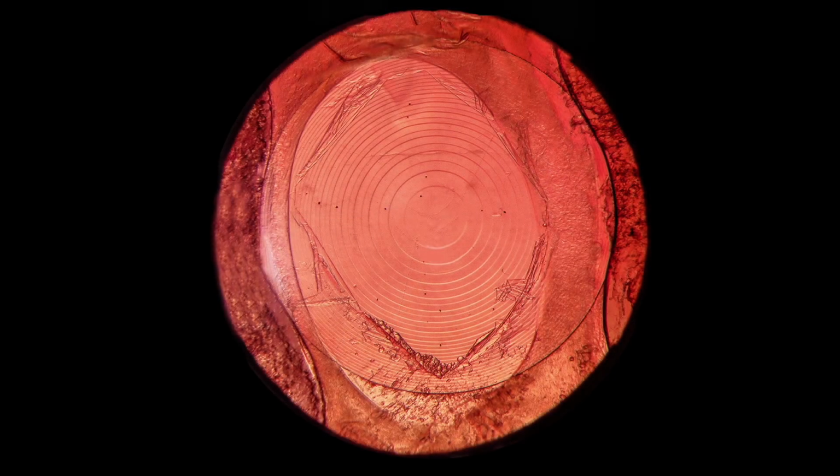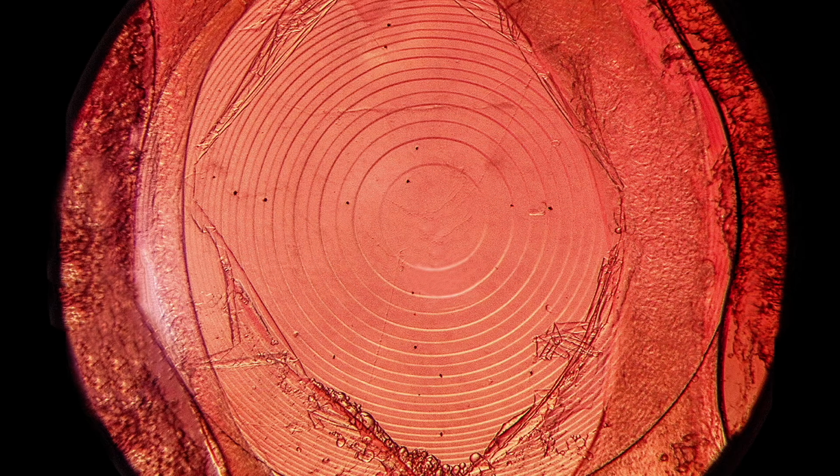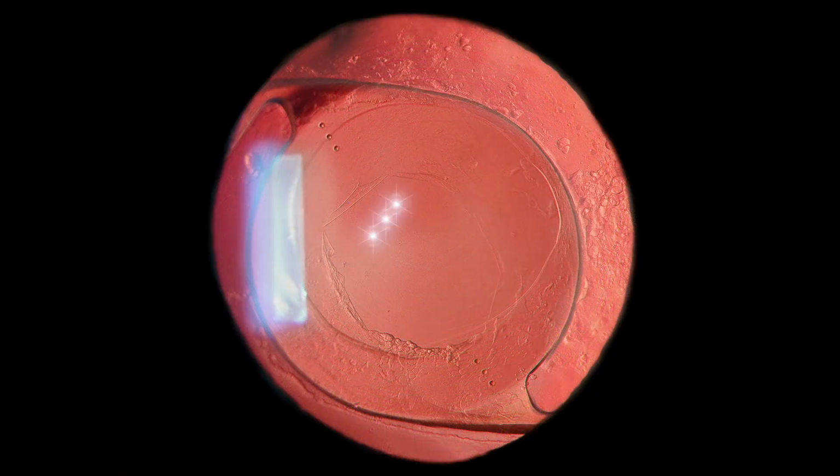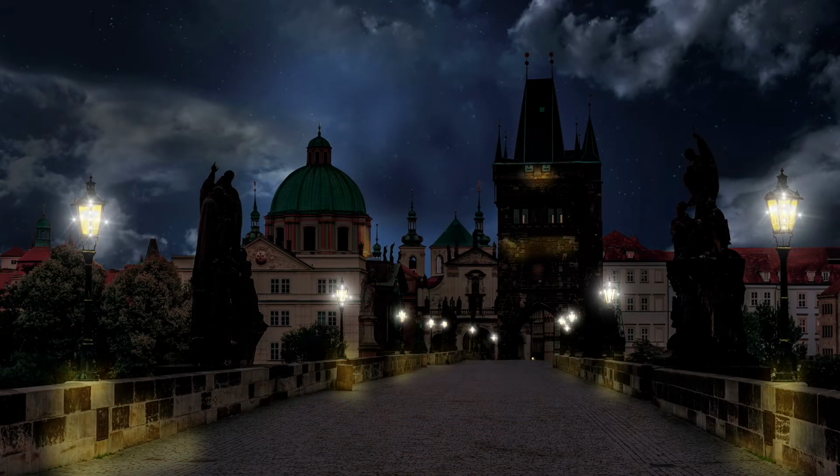One of the YAG laser treatment options is the cruciate pattern technique. The YAG laser is used to create a cross pattern which allows the capsule flaps to retract out of the visual axis. Care must be taken to aim the laser beam carefully to avoid pitting the optic. IOL pits in the optical axis can lead to disturbing light effects.